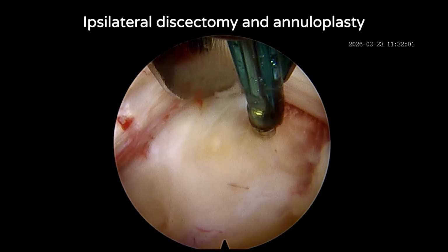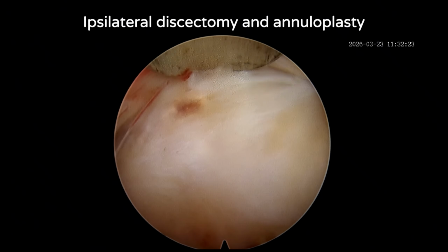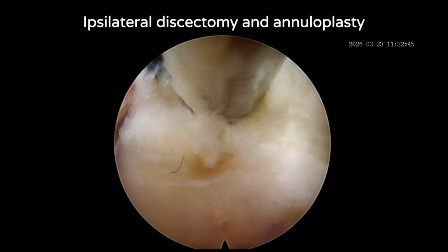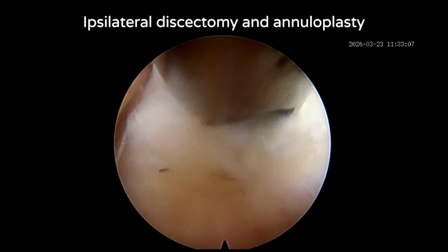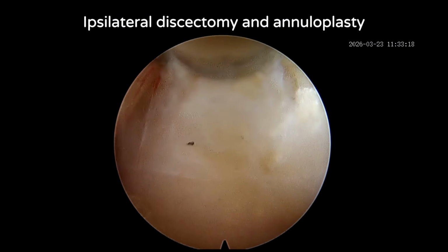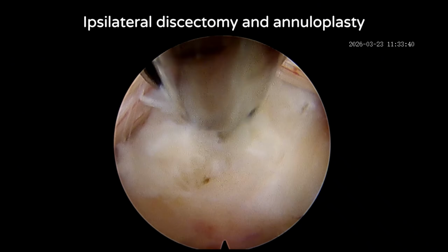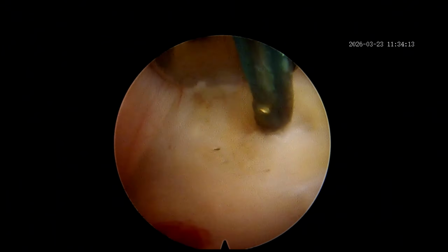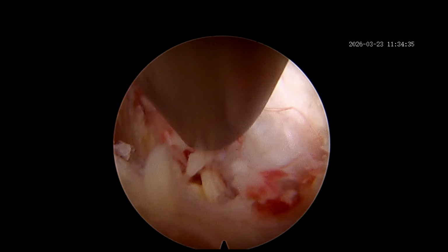Once you remove the ligamentum flavum, you can just retract the traversing nerve root using the RF probe, flexible probe, and you can do a bit of the annuloplasty, cut the annulus, do the discectomy. Yes, this is really very important. All the instruments should open once you are inside the disc, and then you remove the disc. And whatever free fragments there are, you should remove. If there are no free fragments, no need to do the radical discectomy. Do the annuloplasty and come out.